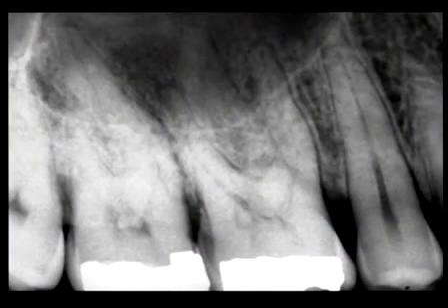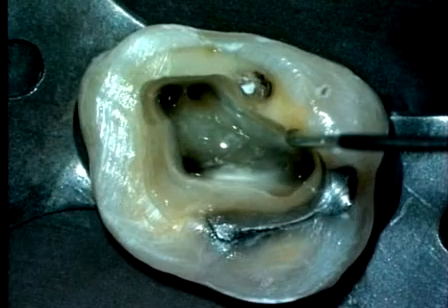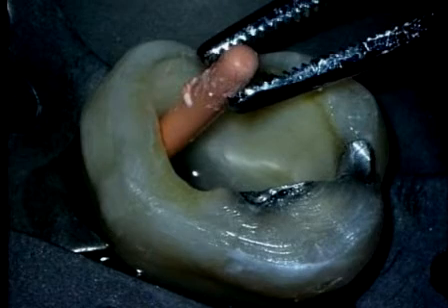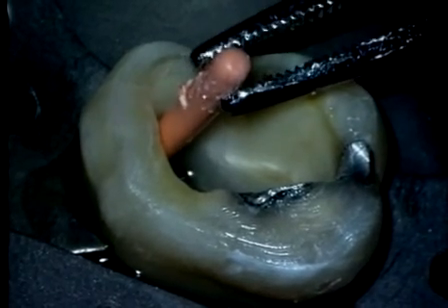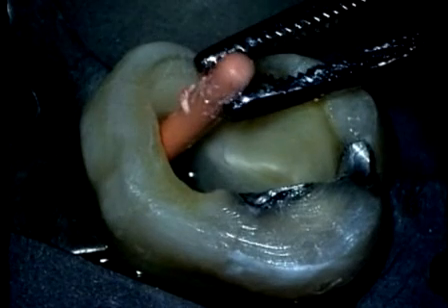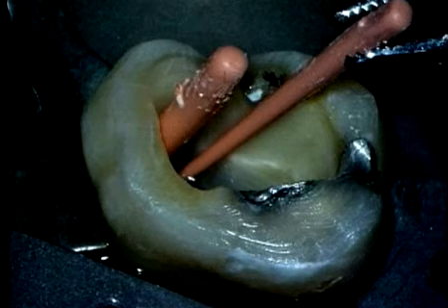Let's look again at the preoperative film of the maxillary first molar where we previously cleaned and shaped the MB1 and MB2 systems. A fully tapered medium master cone is trimmed apically so it exhibits short, crisp tugback. Leaving the medium master cone in the MB1, we select a fine medium for the MB2 and we trim it and size it as previously described.